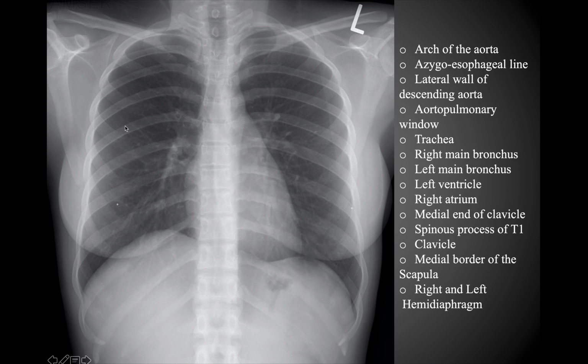Another thing to keep in mind is, especially in females, the breast will cause a shadow effect. That's totally normal, so don't think that that's an abnormal chest x-ray. You just want to pay attention to that. Keep in mind you'll also be able to see the nipple shadow. Oftentimes you don't see it well in this image, but we'll see one later on where you can see that quite well.